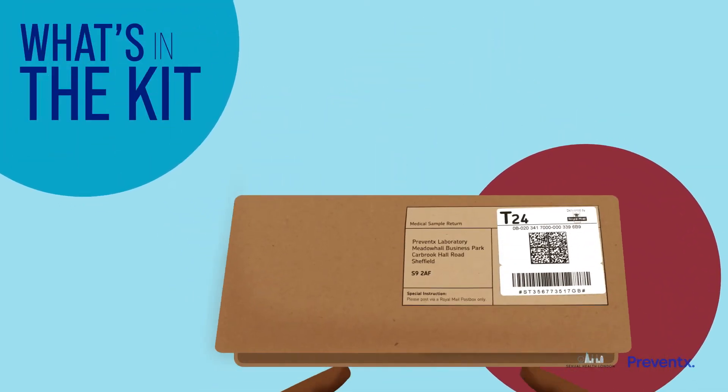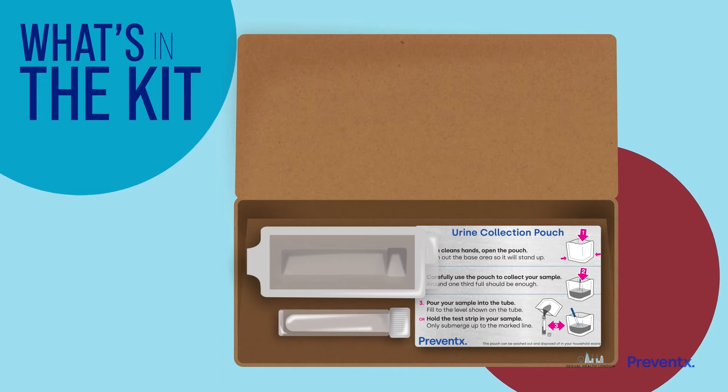To take this sample you will need the urine pouch and collection tube from your kit, as well as the urine transport pack to hold the tube once you're done.